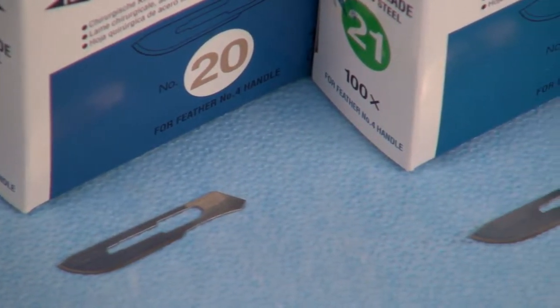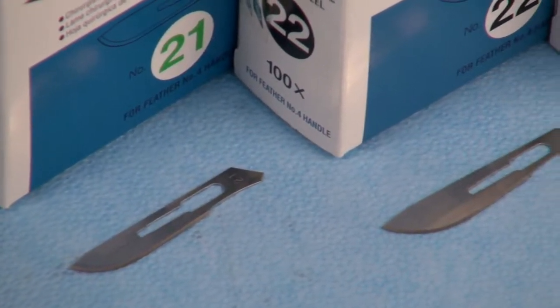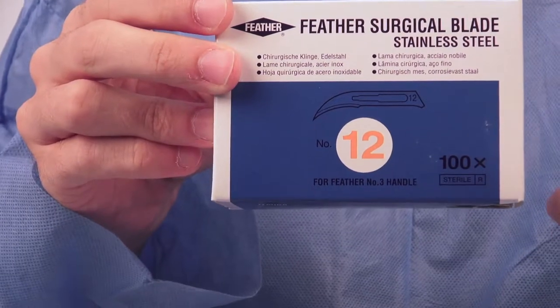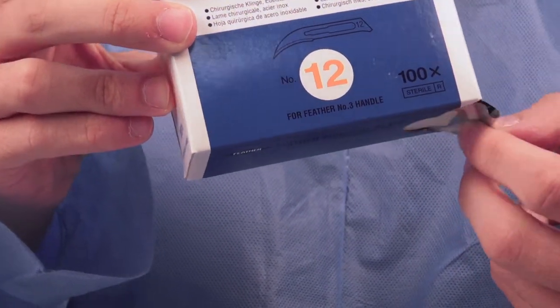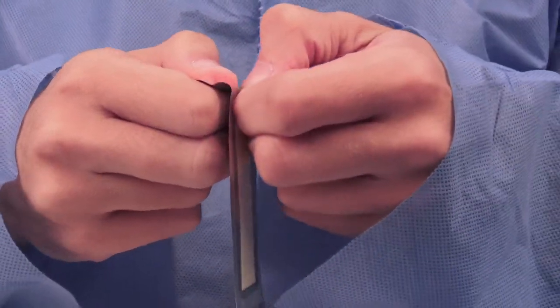Feather's heat treated stainless steel blades provide superior cutting quality and strength. Packed 100 per dispensing box, these blades are single use, sterile, and in color-coded packaging to assist in blade identification.